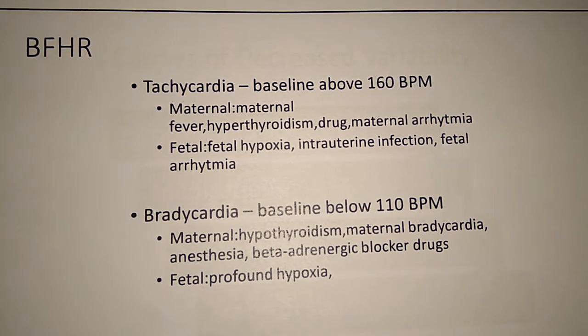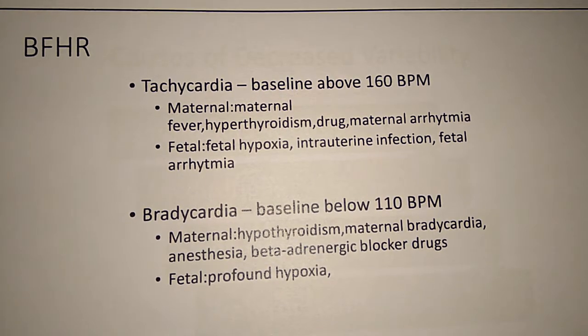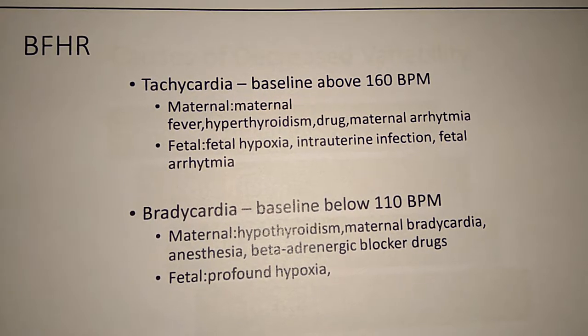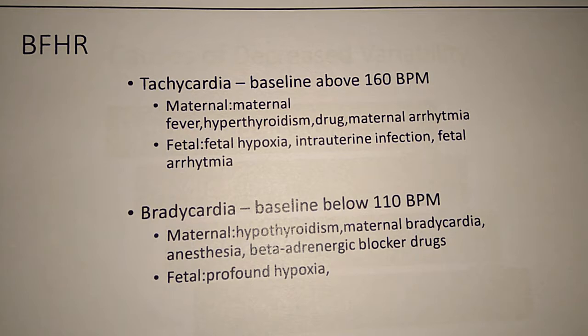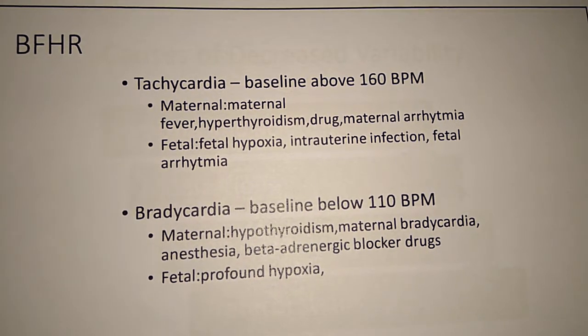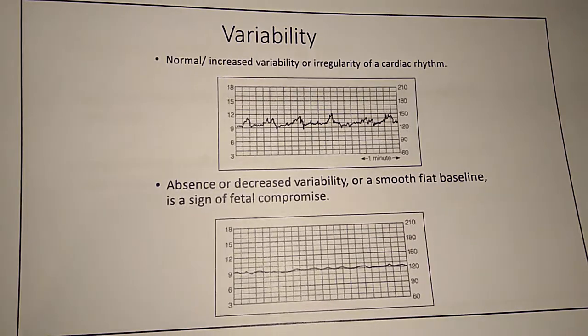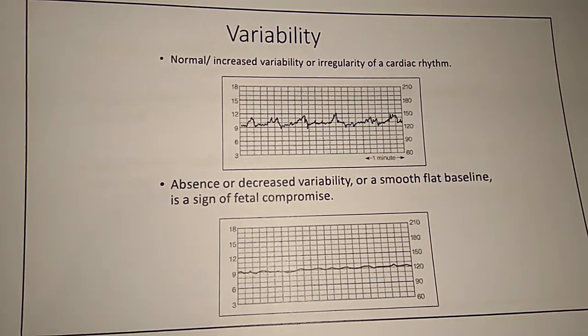Bradycardia can be caused by maternal factor and fetal factor also. Maternal factor: hypothyroidism, maternal bradycardia, anesthesia, beta-adrenergic blocker drugs. Fetal factor: profound hypoxia. The second parameter will be the variability.